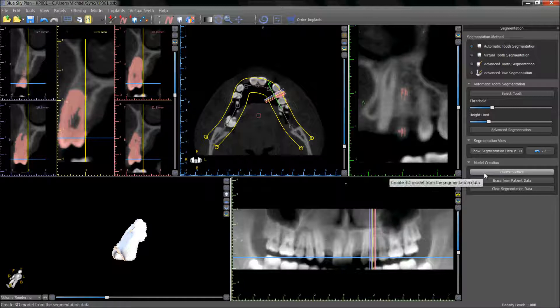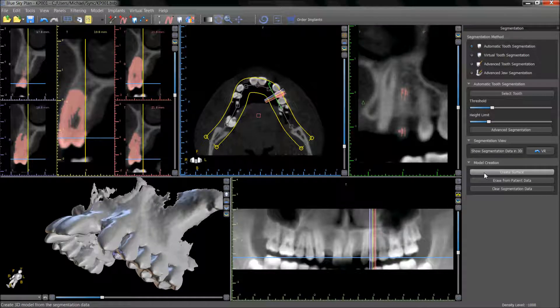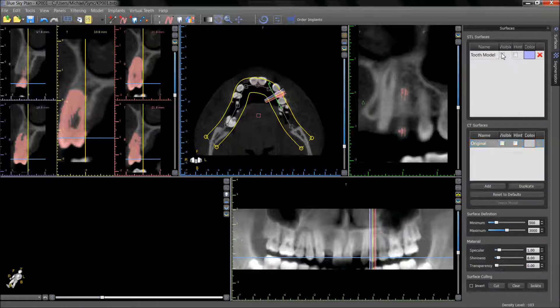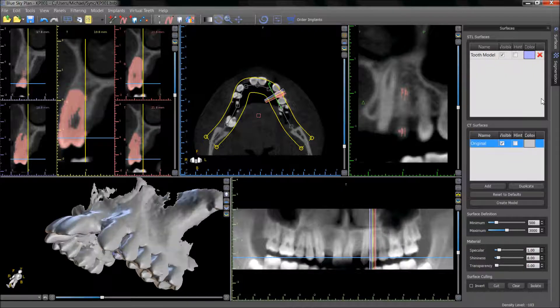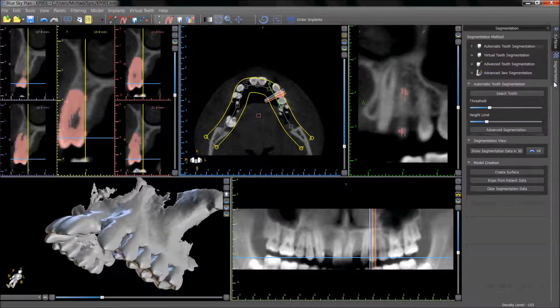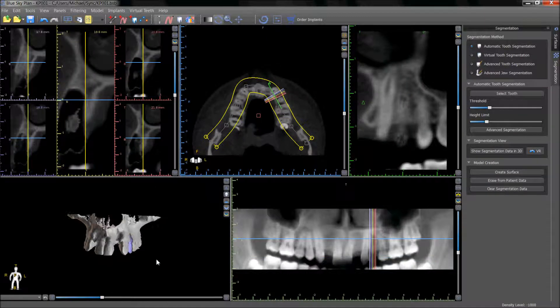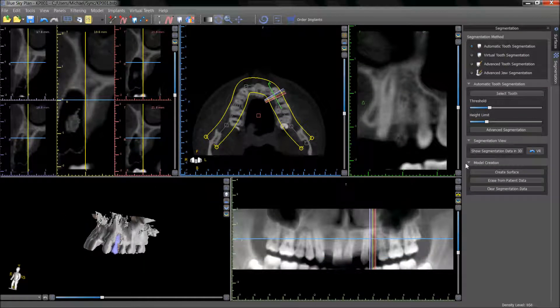Pressing create surface will turn the segmented tooth into its own surface in the surface panel. Pressing erase from patient data will extract the tooth from the 3D and 2D views.